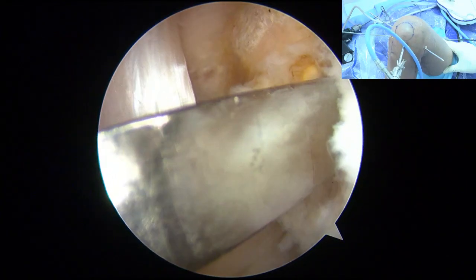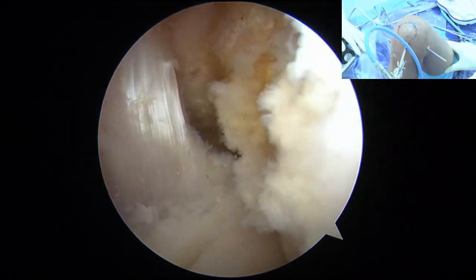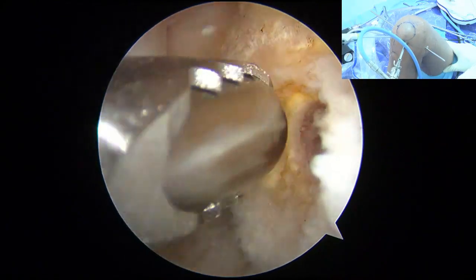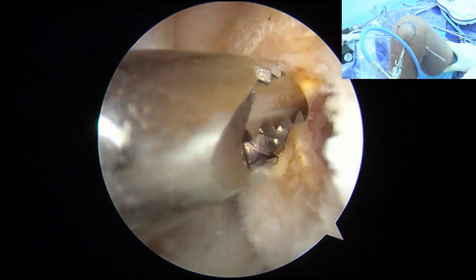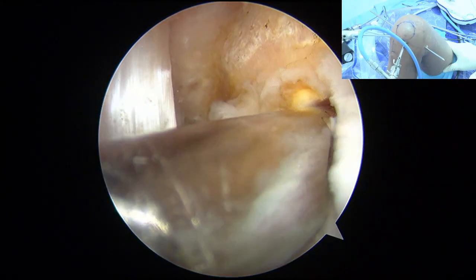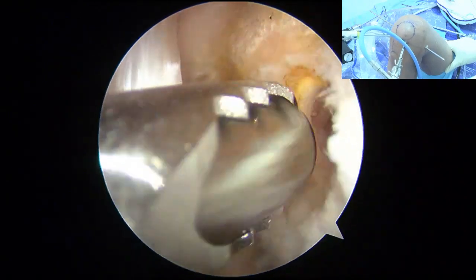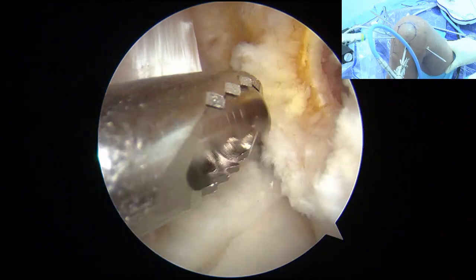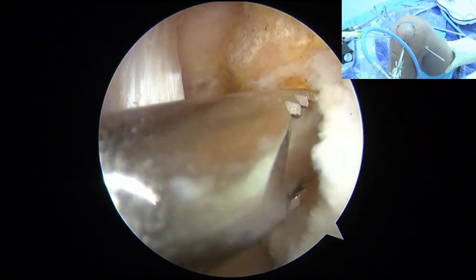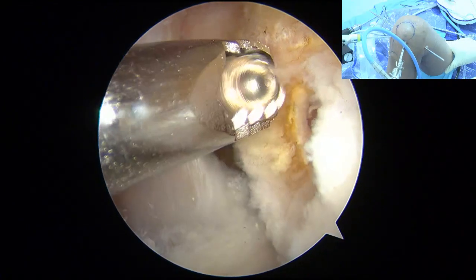36是吗？今天量出了36。36，OK，36好。Okay, good. 36. So, we plan to put in the tunnel. The shortest that we have studied to put in the tunnel is 11 millimeters. So, we did the MRI study and also a clinical study. Even if we put in 11 millimeters, this can heal in the tunnel. Okay, no worry, because you have good metaphysis, metaphyseal cancellous bone, 1 centimeter, that's enough for healing.